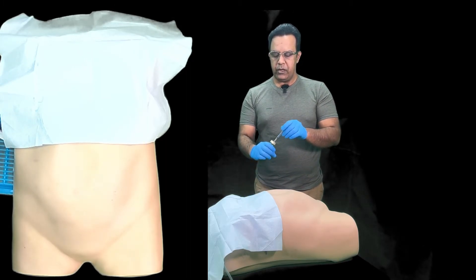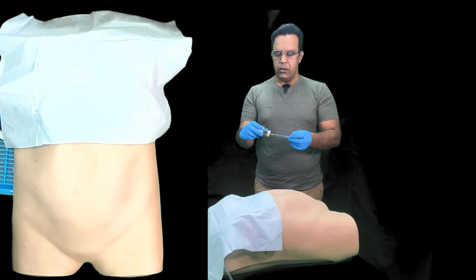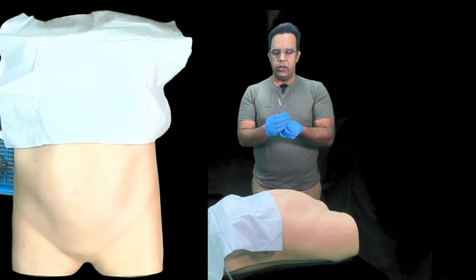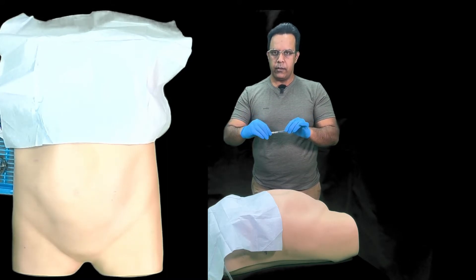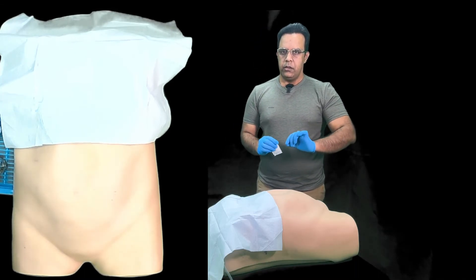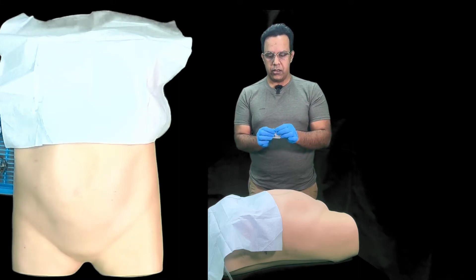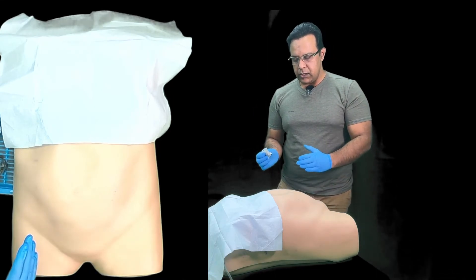Take the appropriate dose of the medication, clean the vial, draw up the dose, and remove any air bubbles from the syringe. Put the cover back on. Ideally you should change the needle at this point — do not use the same needle you used to draw up the medication when you inject the patient.